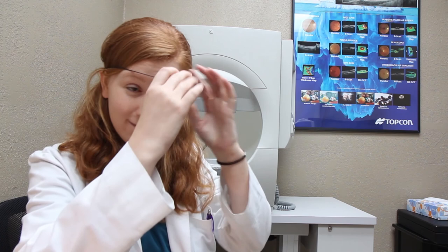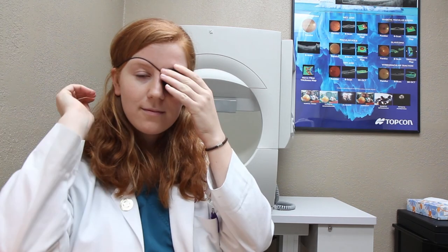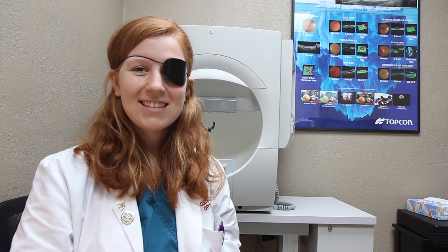Put the eye patch over your left eye. Make sure the elastic does not touch your eyelid. You can blink normally during the test, but make sure you keep your eyes open wide.